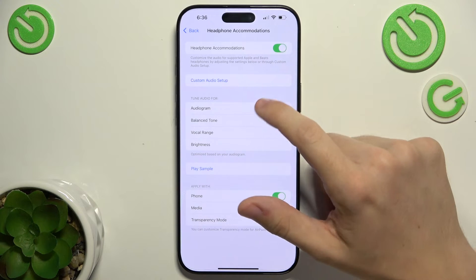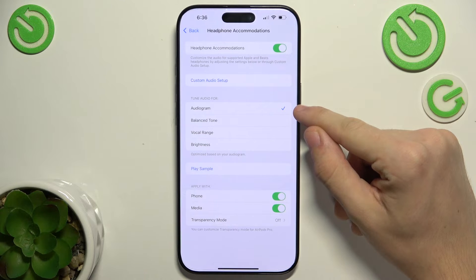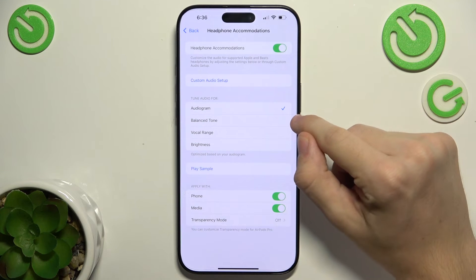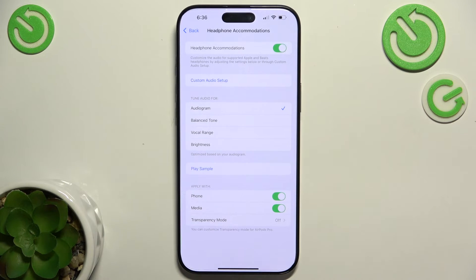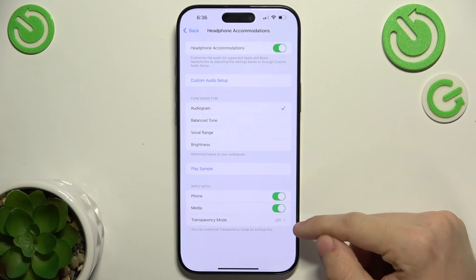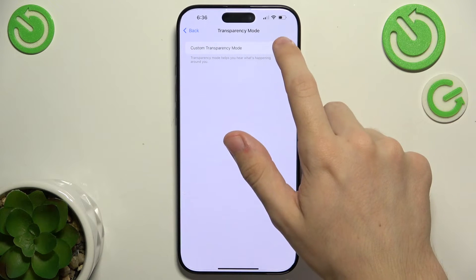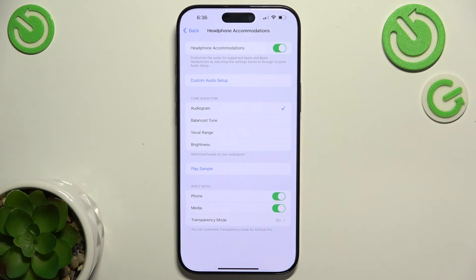Here I can tune audio for my audiogram if I've added one — I'll show you that in a second — or choose balanced tone, vocal range, or brightness. I can play a sample and choose whether to apply it with phone, media, and transparency mode. I'm going to enable it for transparency mode, and now I hear the amplification of sound adjusted to my audiogram.